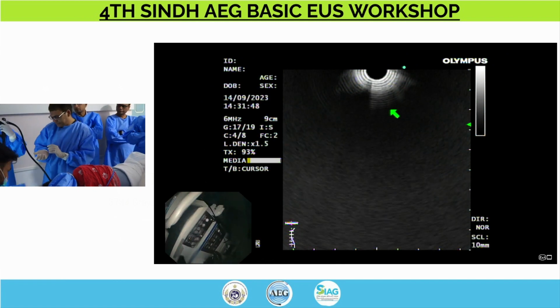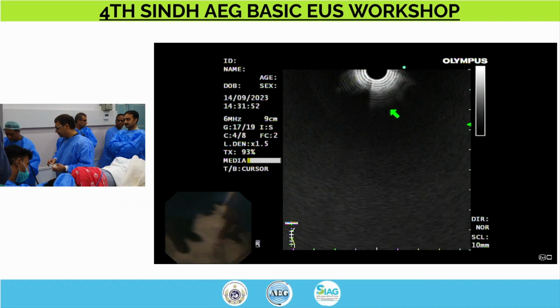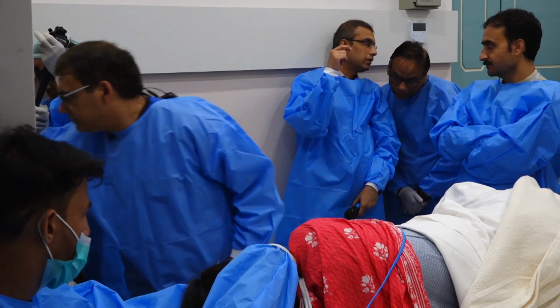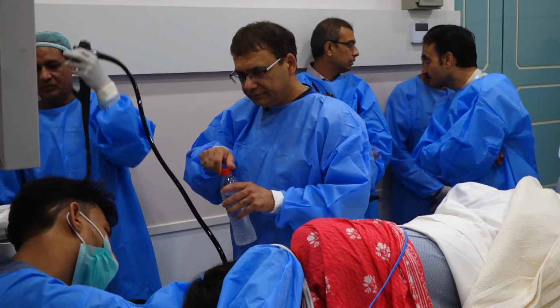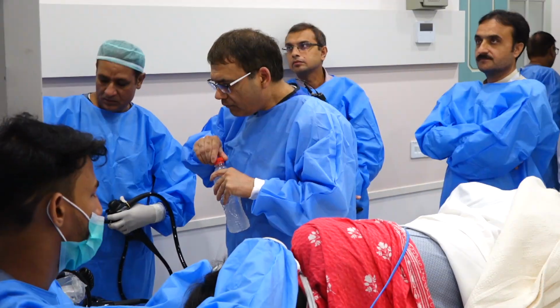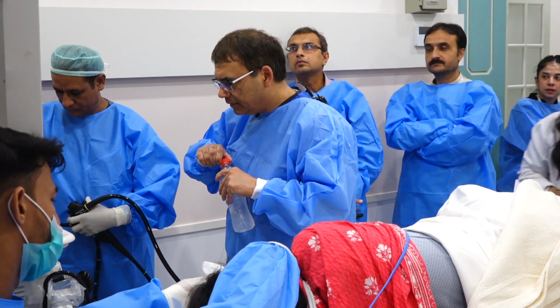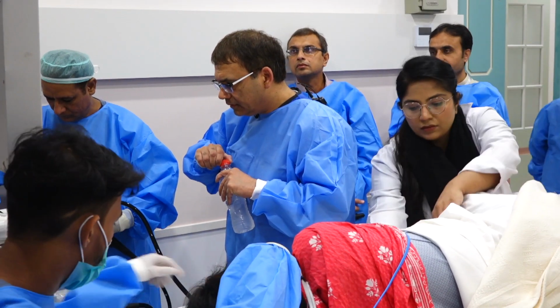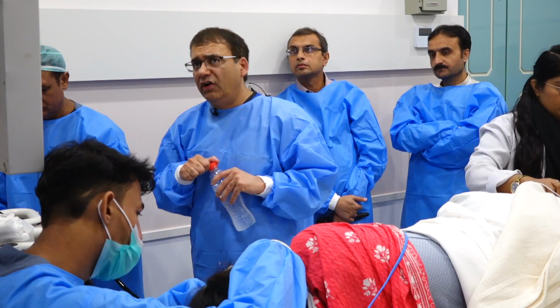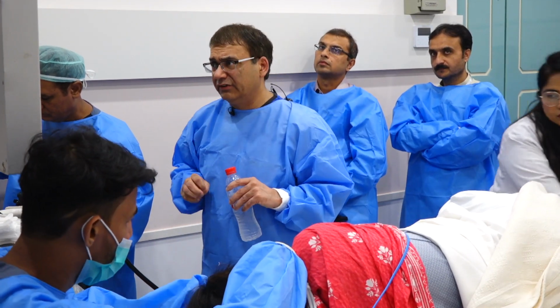Kambi's questions? That was a beautiful demonstration, Dr. Hassan. Thank you. One question I had was, you evaluated that pancreatic duct in the head of the pancreas in the uncinate process, and then you were able to, with one motion, track this down into the body and the tail. Does that effectively rule out a pancreas divisum? Yes, I think if you can follow that from the ampulla all the way to the tail, that pretty much rules out pancreas divisum.